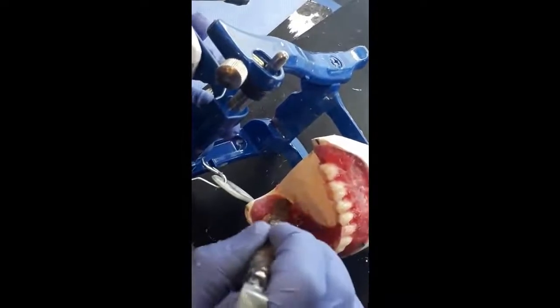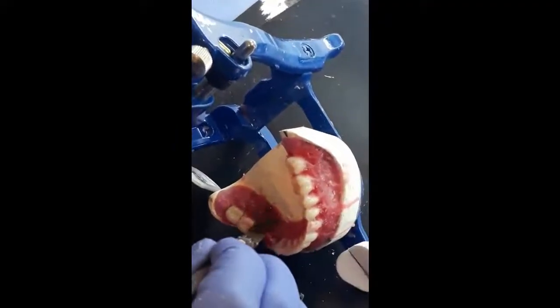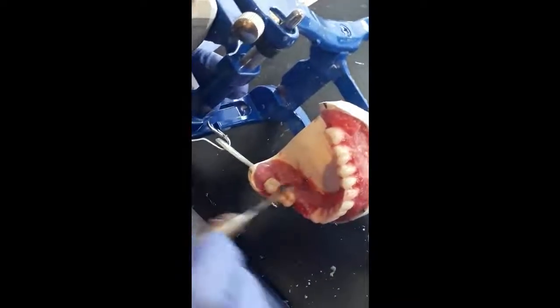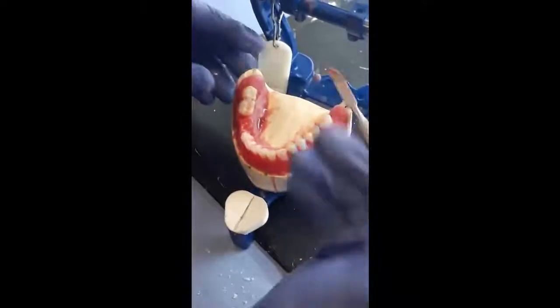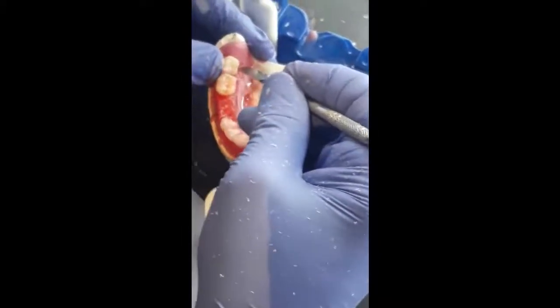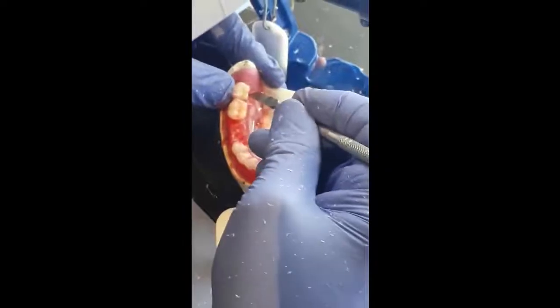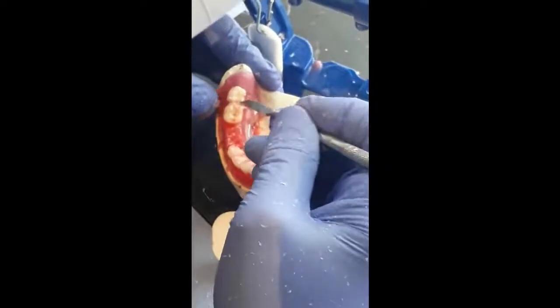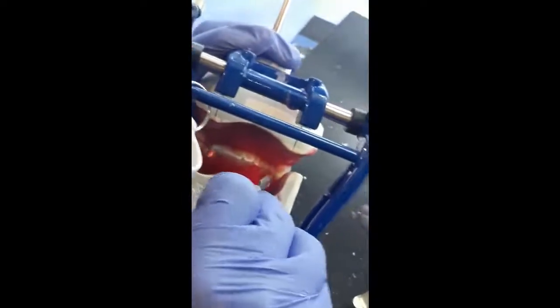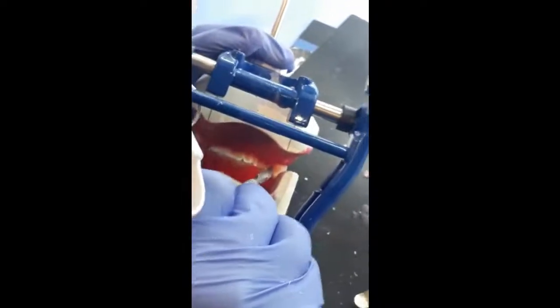I have to keep the wax in good shape. Now with a cold instrument we can adjust the tooth a little bit more. You see now it articulates nicely with the maxillary second molar, and we observe the occlusion from the lingual side.